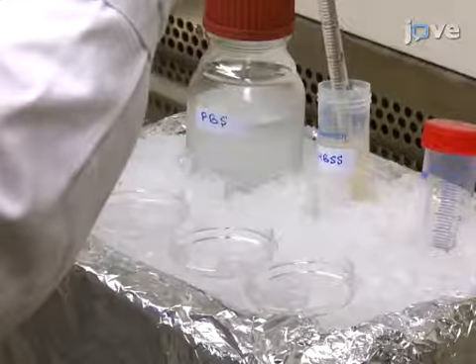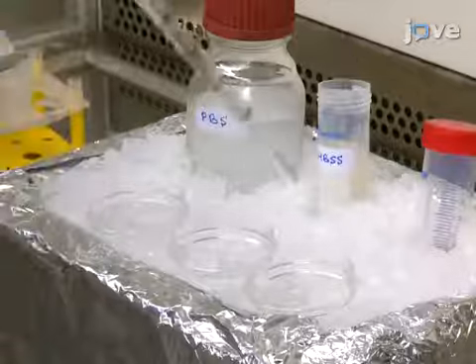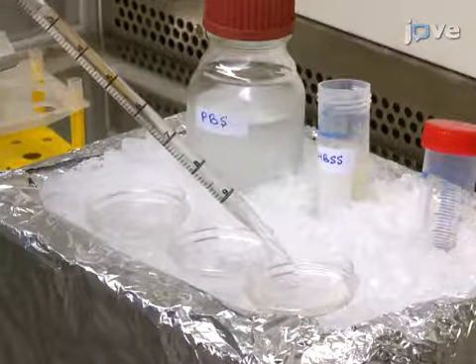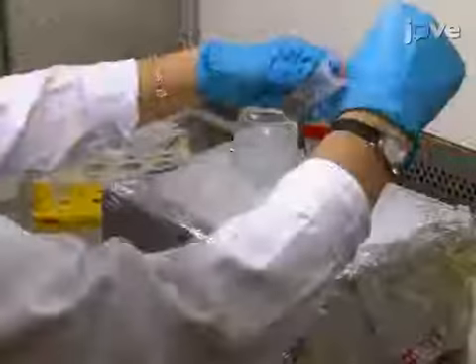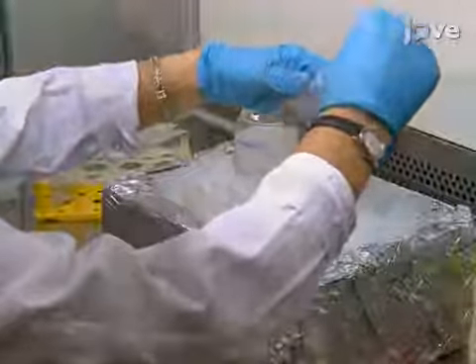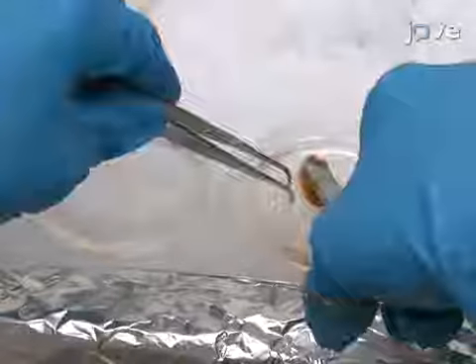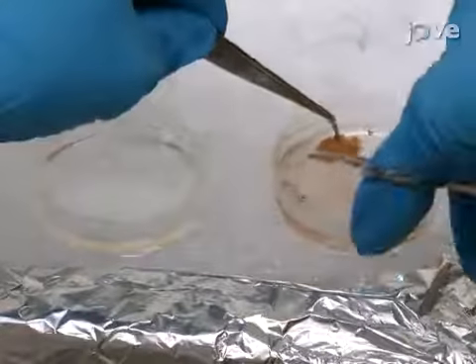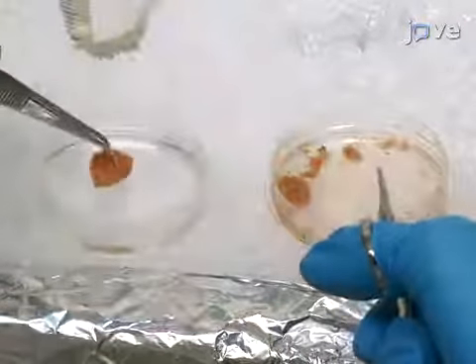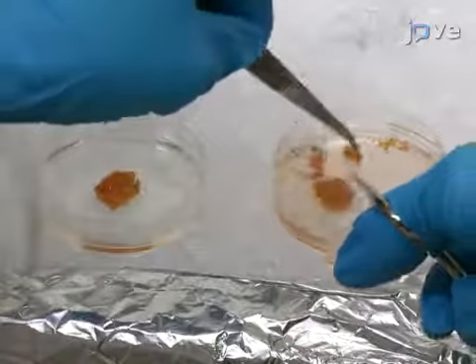Then, using the appropriate biosafety procedures recommended for handling human tissue, moisten the tissue with fresh supplement-containing HBSS and transfer the tonsils to a 60 millimeter plastic cell culture plate on ice. Using forceps, remove any visible blood clots or fatty and connective tissues, then transfer the tonsils into a new 60 millimeter plate containing 5 milliliters of HBSS with supplements.